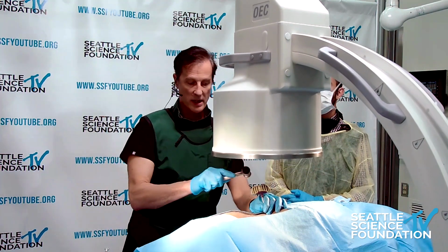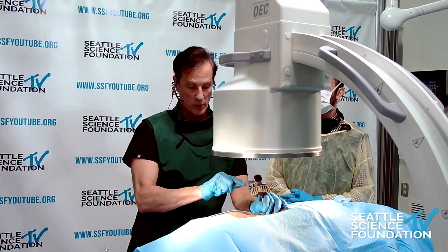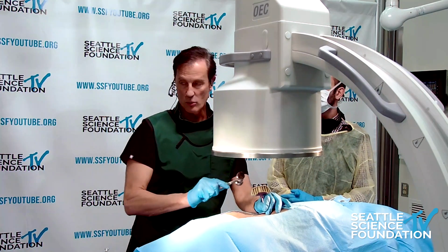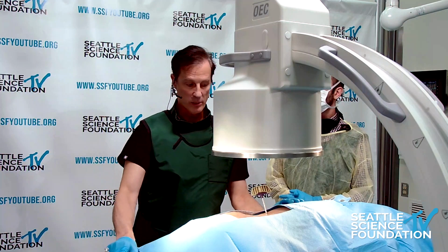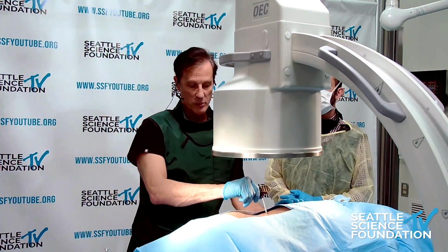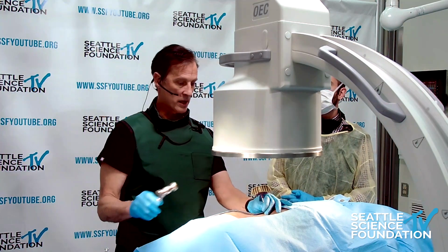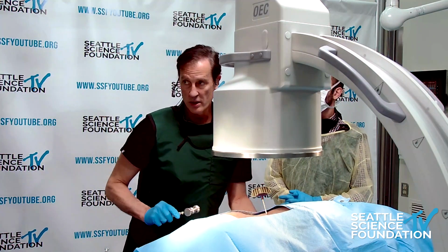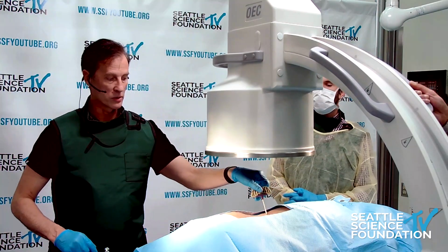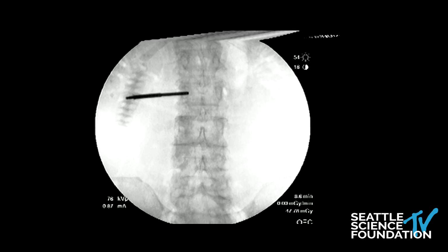So I'm going to go down, and before I transgress the medial wall, because we're approaching that, and it's getting very close, and we're right at the medial wall here, the needle tip. So I'm going to turn from the bevel sharp point facing away from me to facing to me, and watch what happens. And it will give us about 2 or 3 more millimeters of distance there, and we will go down. And now we'll take another lateral look, and we'll find ourselves in the posterior portion of the vertebral body wall.